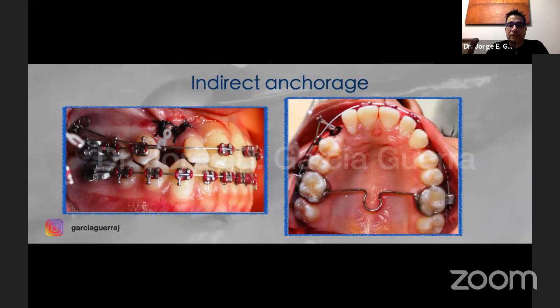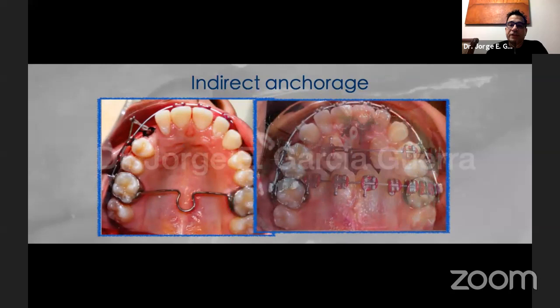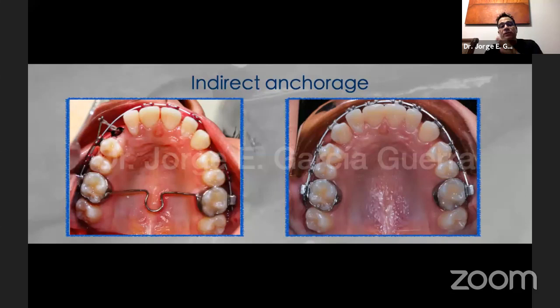Okay. A little bit further on in this lecture, I'm going to show you a couple of cases that we did with impacted canines. In this case, we use this mini implant or mini screw for indirect anchorage with a lever arm, so we can traction out the canine. And that's a very common situation that we have in our practices.